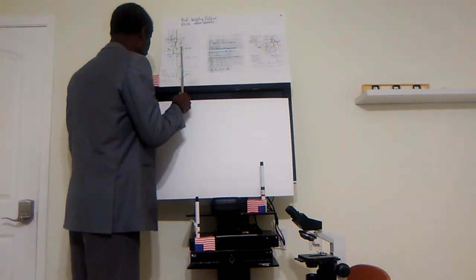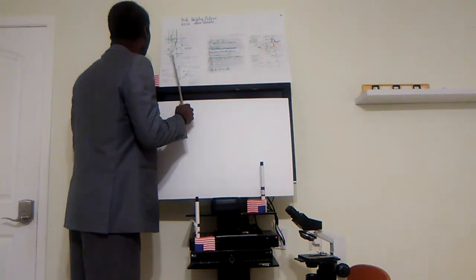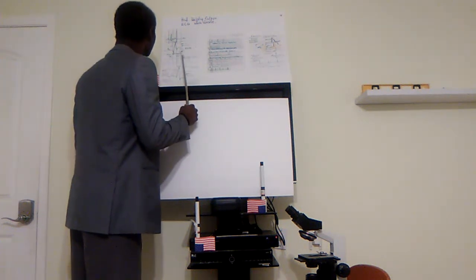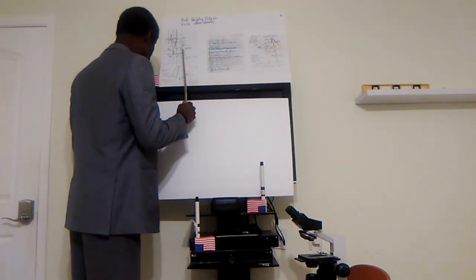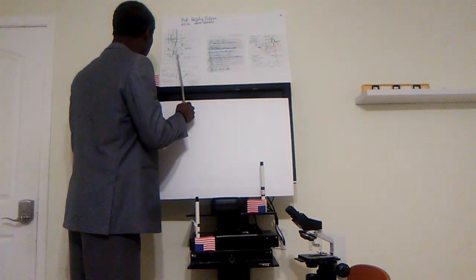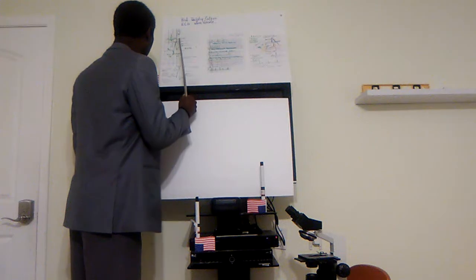And we know that there is elevation in the ST waveform here. This is the PR interval from here to here, and this is the QT interval from here to here. From here to here would represent the QRS interval.